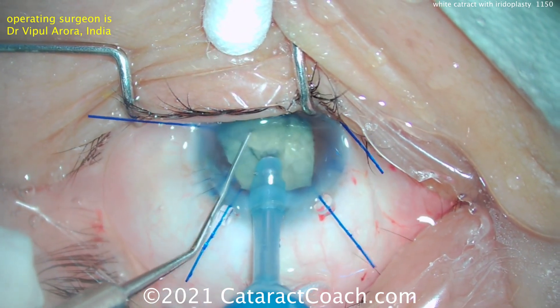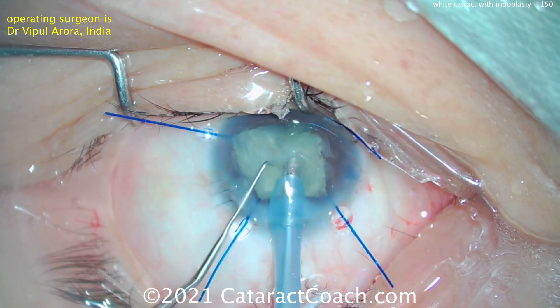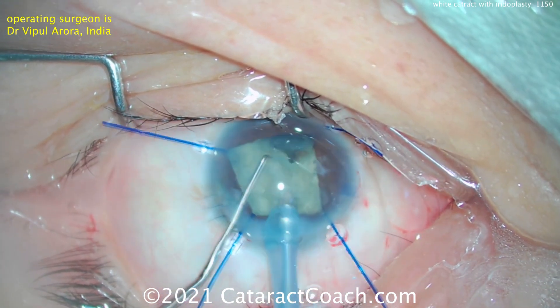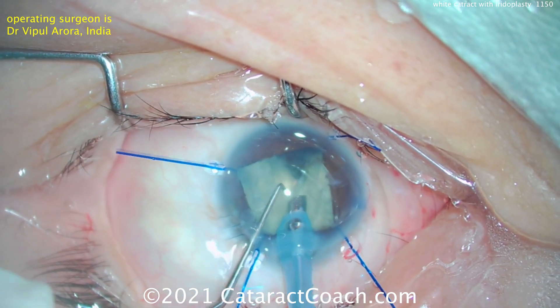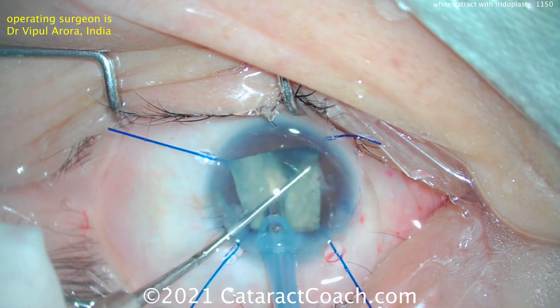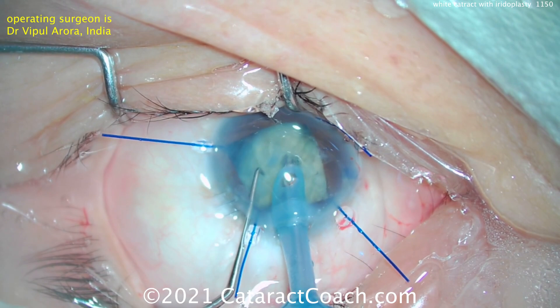Of course, we have to fix the cataract, but in addition we also have to repair the iris, so there'll be an iridoplasty here. Good job in taking out the cataract. You notice the original incision there is temporal with the three sutures in it — those placed by the other surgeon.